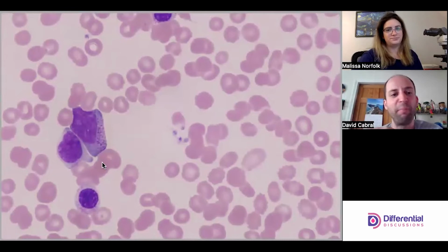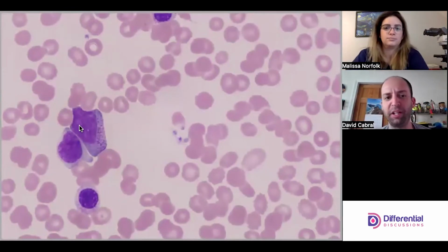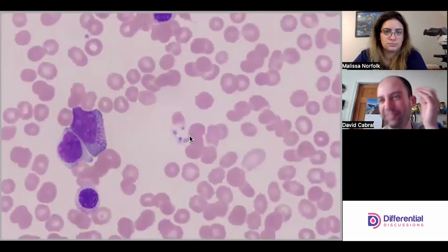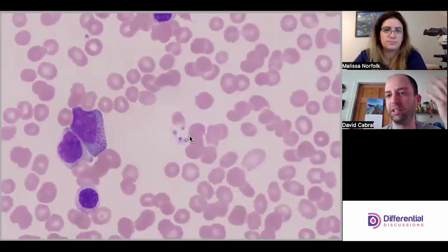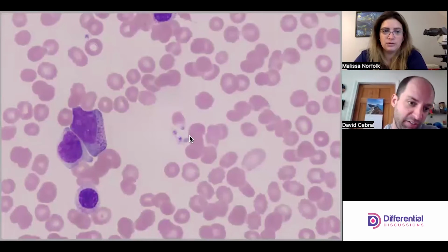You have big nucleoli, but you've got a blue cytoplasm. You've got those pretty primary granules. I still have a spidey sense in me that's like, this isn't a normal cell, right? But it's definitely a promyelocyte. And then of course we have this lack of contact inhibition. It's got this up close to its buddy here.